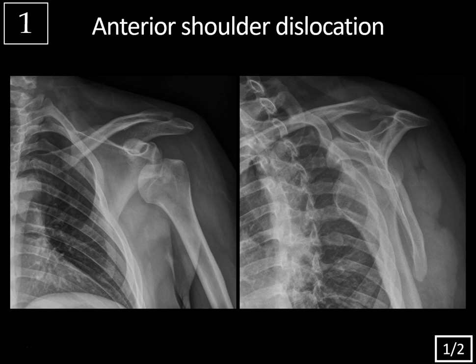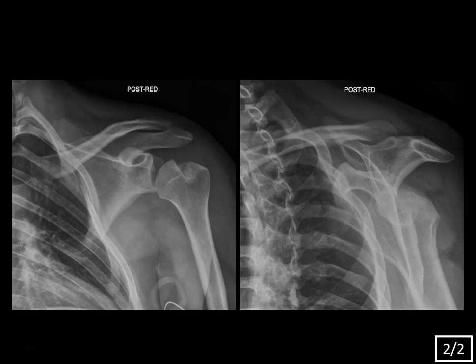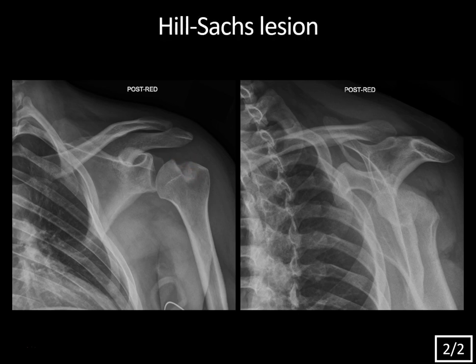The other is a Bankart lesion, where you have a fracture of the anterior inferior glenoid. We don't see a Bankart fracture here, but on the post-reduction images there is a large impaction fracture involving the humeral head — typical for a Hill-Sachs lesion. The humeral head is a bit low-lying relative to the glenoid with some inferior subluxation, but no dislocation. Notice how the scapulohumeral arch now has a normal contour, without that bulbous distortion from before.